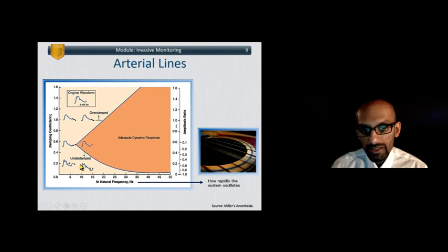And that brings the biologic system, the patient's body, the arterial pulse frequency range, into the same range as the natural frequency of the catheter-based system that's monitoring it. So there actually is some overlap, and the two will ring, and what you'll see is essentially what's called an underdamped waveform. You get higher than normal systolic. There's a lot more oscillations there.